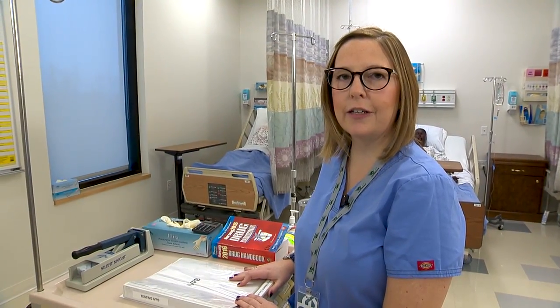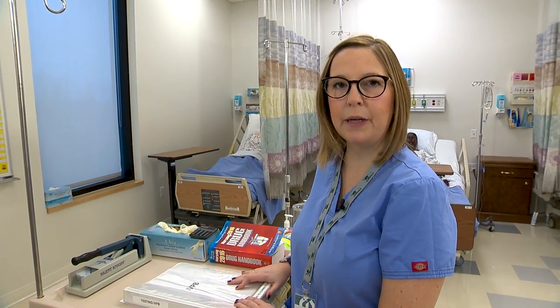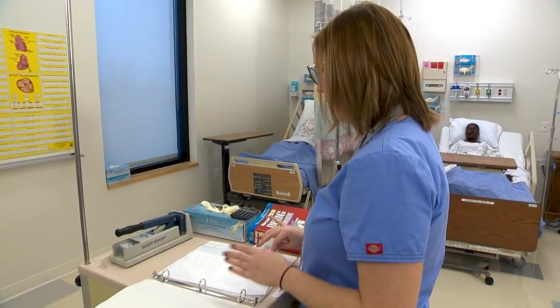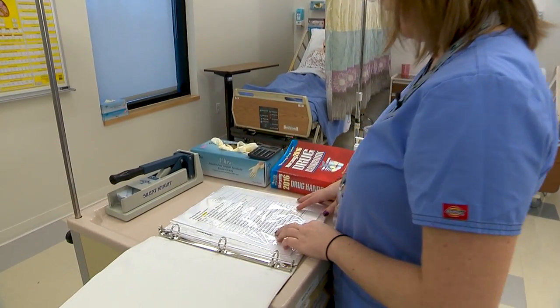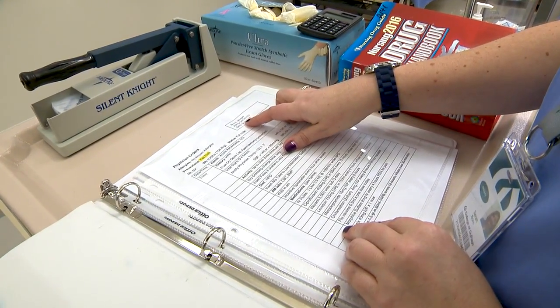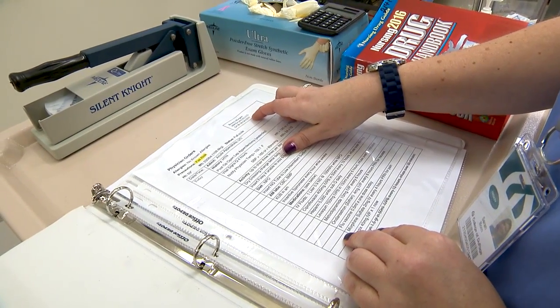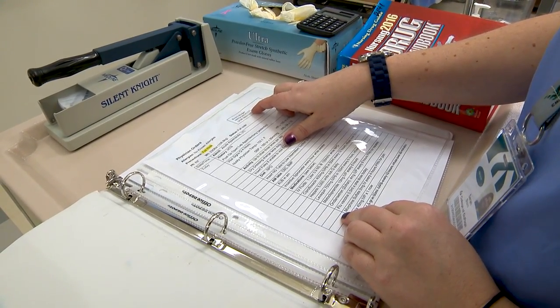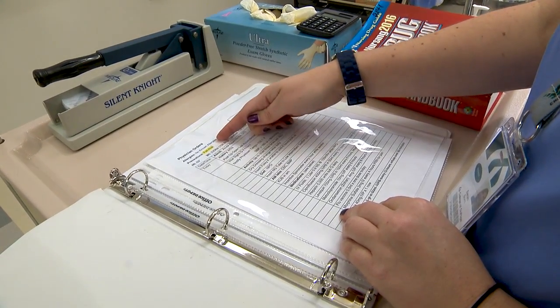Hi, I'm Sara, and today we're going to do IV piggyback. I have my patient's chart here. I'm going to verify that I have the patient's name, Morgan Brown, date of birth 8/4/70, MR number 589-135-1325. He has no known allergies.